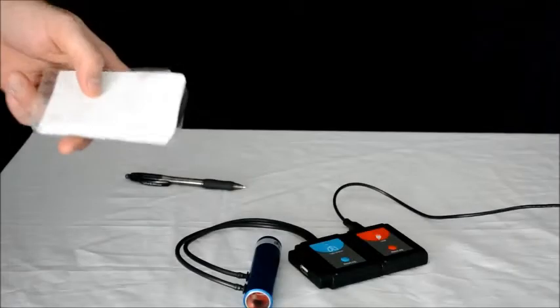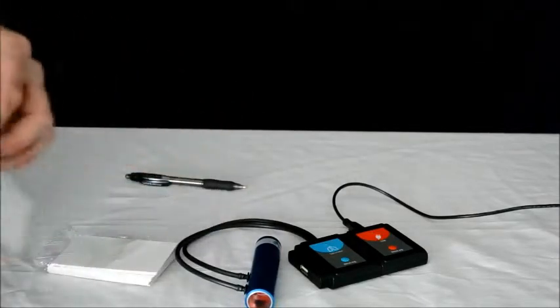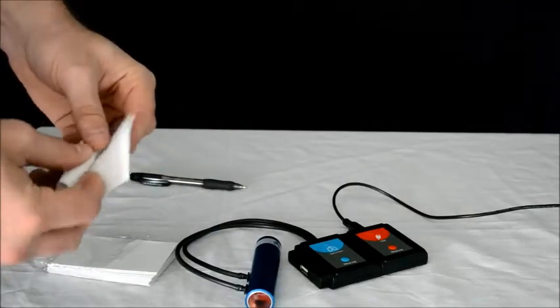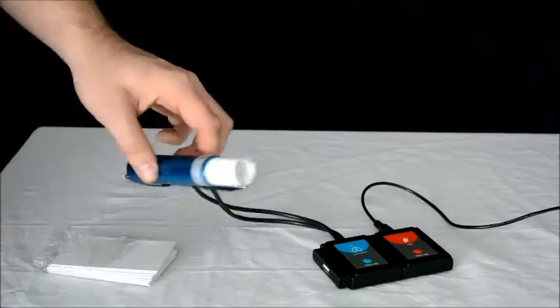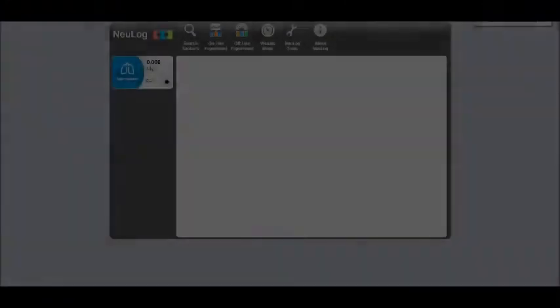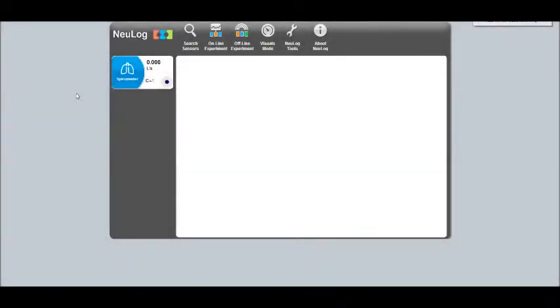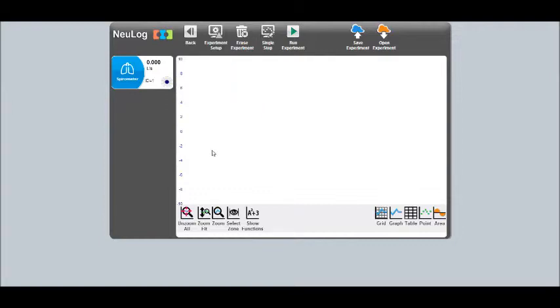A package of laminated paper comes with the spirometer sensor so it can be used by multiple people. Each person would grab their own piece of paper, roll it up, and slide it into the larger opening of the metal tube.